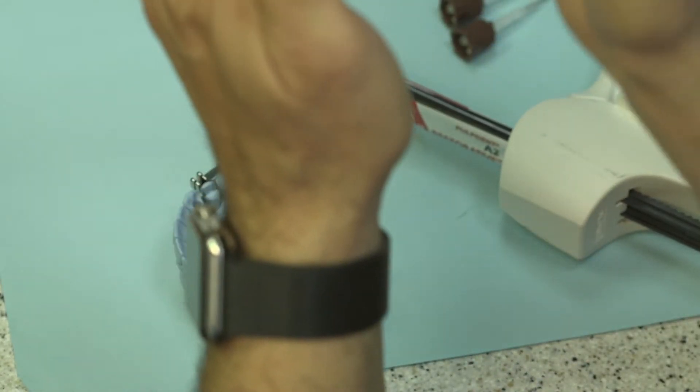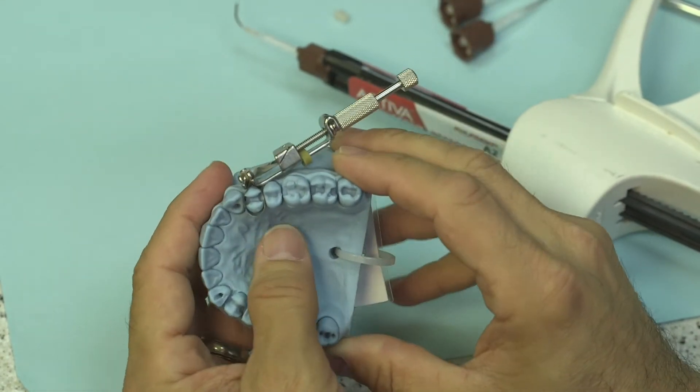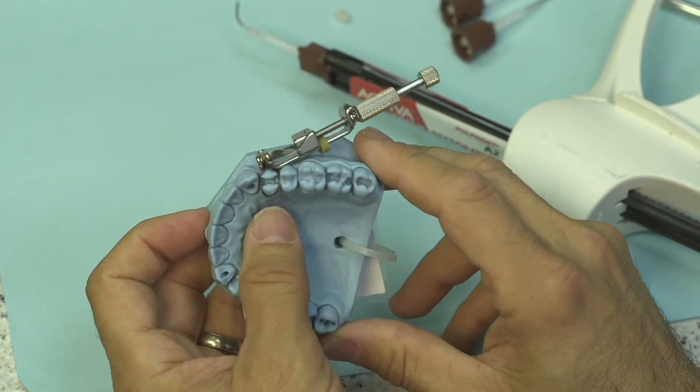In that capacity it's going to constrict the band a lot better toward the gingival and give you a better overall anatomical seal in the restoration that you're going to be placing.